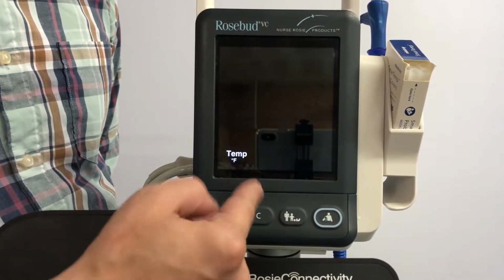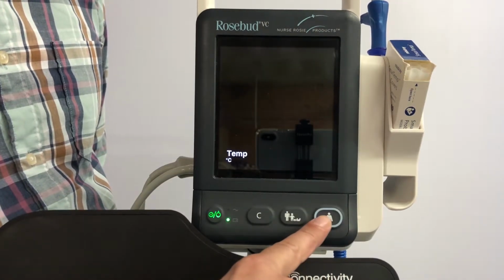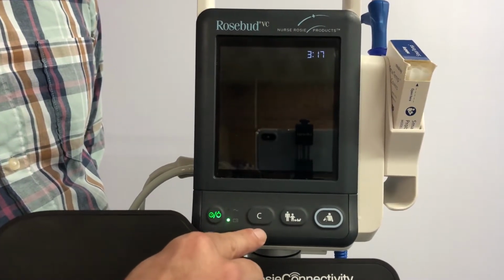Press the C button one more time to cycle to the temperature setting. You can toggle between Fahrenheit and Celsius using the blue blood pressure button. When you've selected the temperature of your choosing, press C again to change to the time settings.